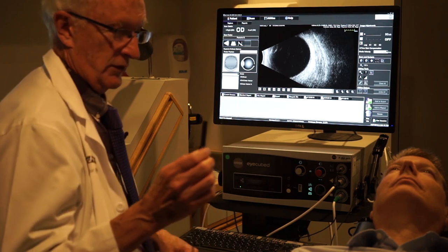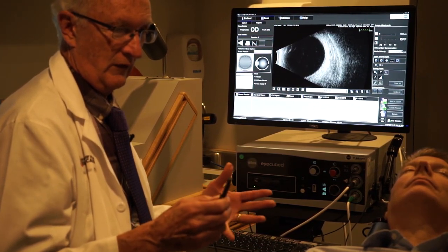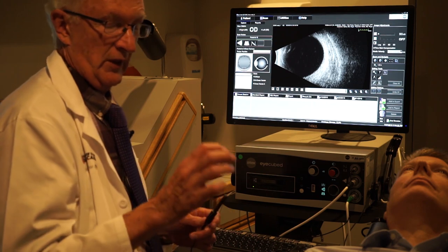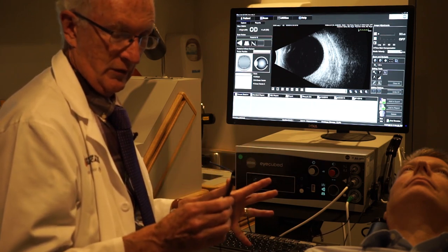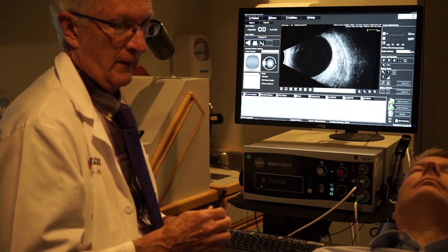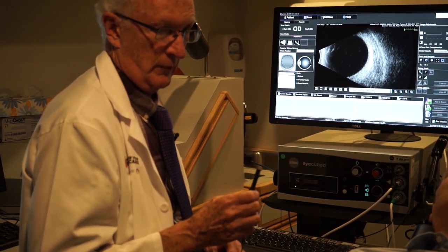The A-Scan is not widely used; most people don't really learn A-Scan. When they say A-Scan, they think of biometry — measuring the eye for axial length measurements for lens implants, using an A-Scan probe for that. But that is not the same thing that I use. This is called a diagnostic A-Scan probe; it's a separate probe, not part of the B-Scan, and it's very useful for many diagnostic approaches.